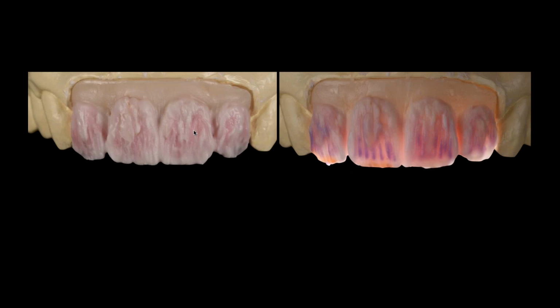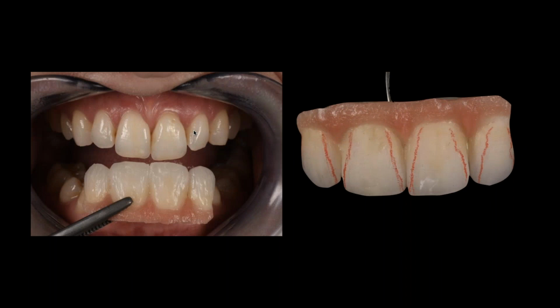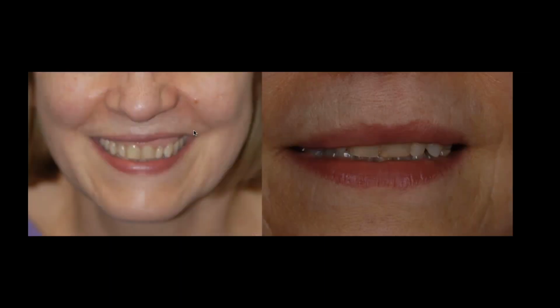But we wound up doing our build-up, our mamelons, our colorations, and trying to put everything in. I added some paint to it, and that was our first fire. And you can see we're fairly close to Rachel's teeth. I think they're not perfect, but for a one bake, we're there. I did a little cleanup and a glaze and finish just because that was all the time we had left. And in the end, I think we're accomplishing so much in such small amounts of porcelain. And I think I owe a lot of that to not only the technology and the machinery, but the ability of the zirconia to actually help me in the process, reflecting and absorbing light.